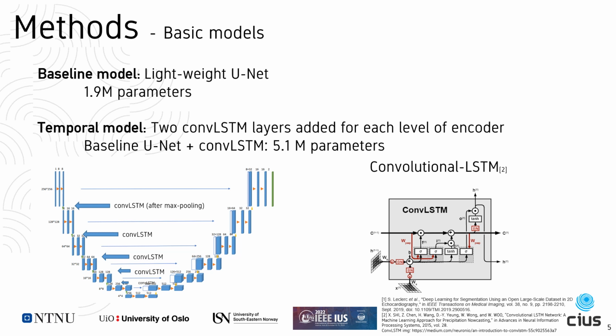Long short-term memory (LSTM) was first proposed for natural language processing, which requires temporal memory to understand the whole context. Later, convolutional LSTM was proposed to capture better spatial-temporal correlations. Besides, to combine UNet and conv-LSTM, there are different possibilities for placing conv-LSTM layers. According to our experiments, the best place is in each layer of the encoder in UNet.